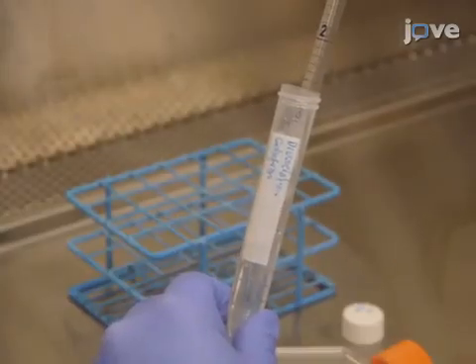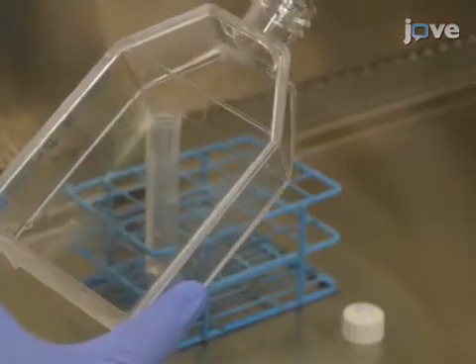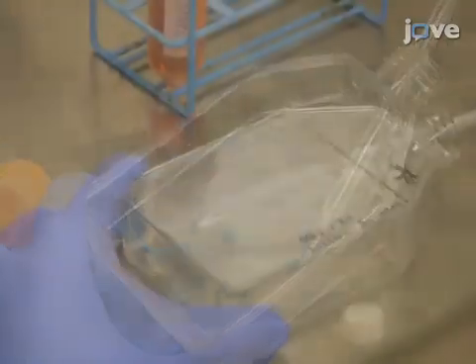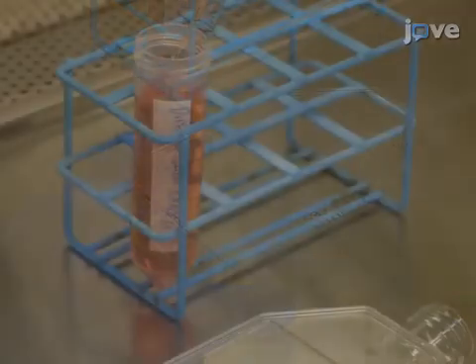Next, detach the RPE cells in the cell dissociation solution for 5 to 8 minutes at 37 degrees Celsius, gently scraping to release any cells that are still attached. Then dilute the cells in the appropriate media.